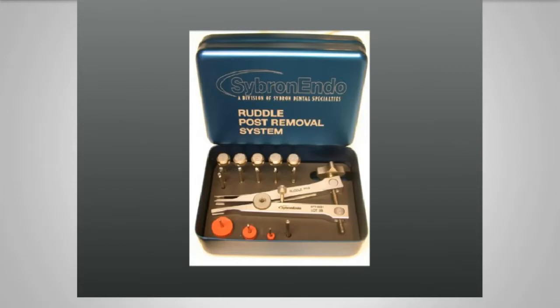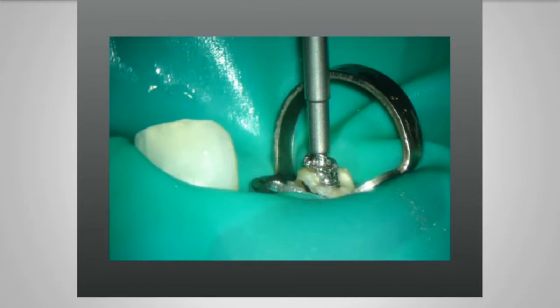The kit consists of a series of trefines that you can use to machine the cast post, and then these extractors which screw onto the machined post. This is then a pair of forceps essentially, so that when you screw down, the beaks open and prise the post out of the root canal. So the first thing you have to do is trim down the core so that you can use one of these trefine drills to machine the post into a cylinder that you can then attach the extractor to.